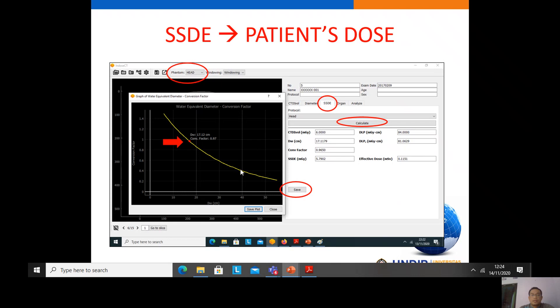A curve shows the water equivalent diameter and conversion factor. We also have the DLP, which is CTDIvol multiplied by the scan length, and the DLP corrected based on the size-specific dose estimate. We also get the effective dose.